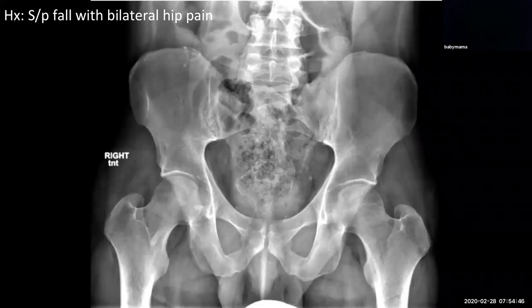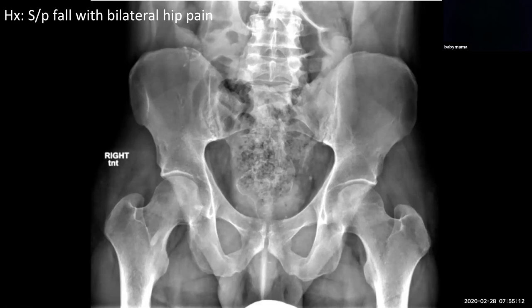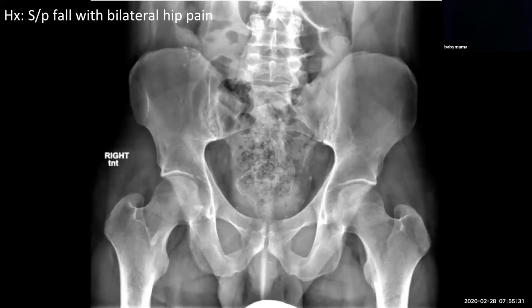How about this case? Similar — bilateral involvement of sacroiliitis, so we're on the bilateral limb of our algorithm. But the answers are usually on the film, and what we see here are subtle surgical suture chains in this patient who had a prior history of enteropathy, IBD, or Crohn's disease. So we can diagnose enteropathic related sacroiliitis in this case — symmetric bilateral involvement of the sacroiliac joints. This person had enteropathic related sacroiliitis.